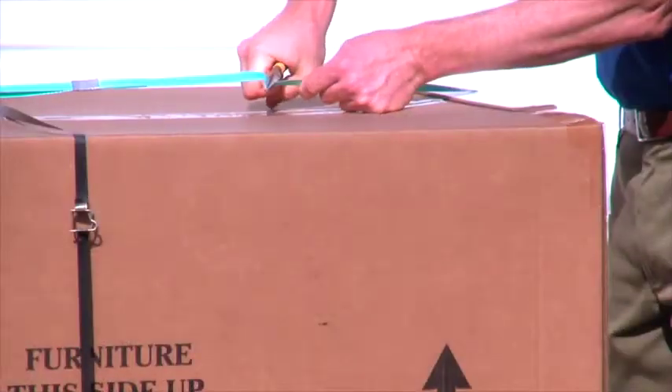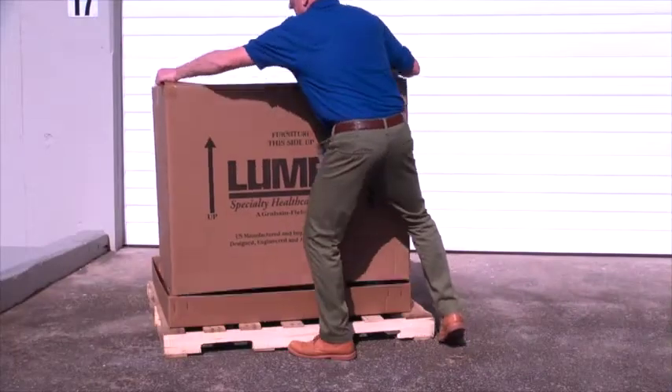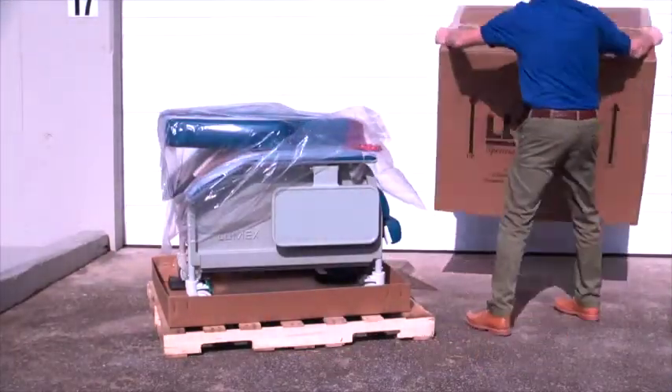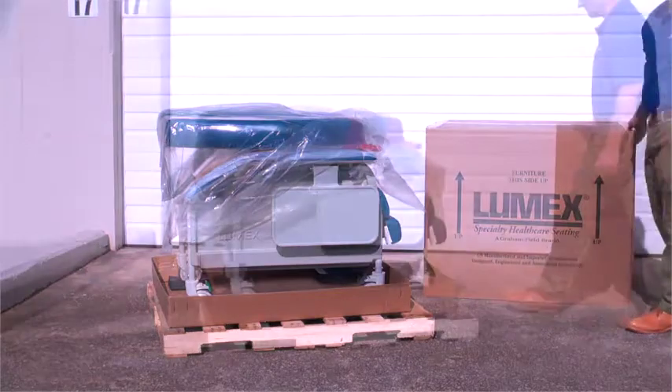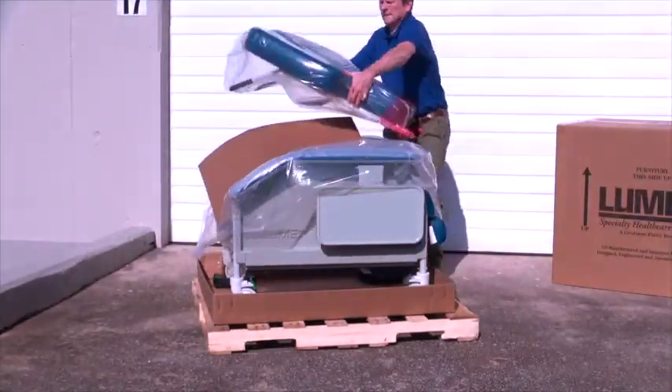With help, lift the carton top off the recliner. Remove the recliner back off of the base of the recliner and set aside. Remove all packaging material from the back and the base of the recliner.